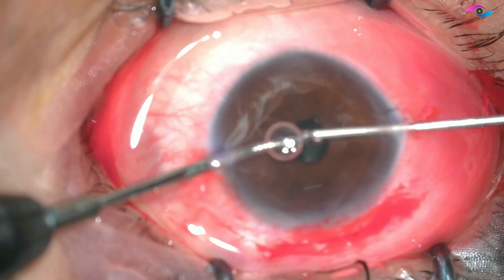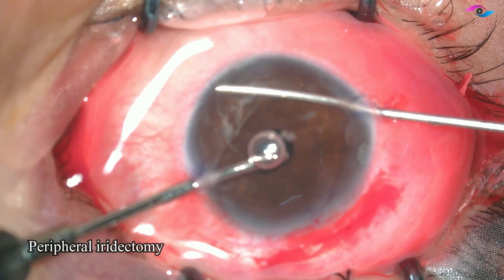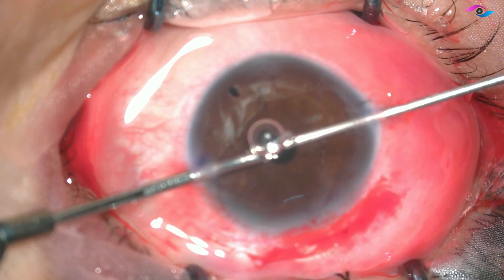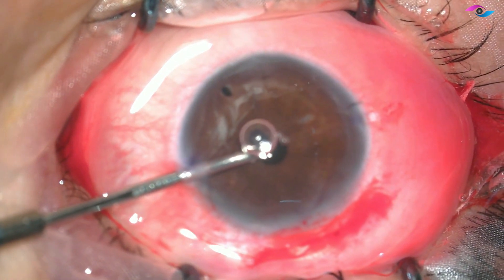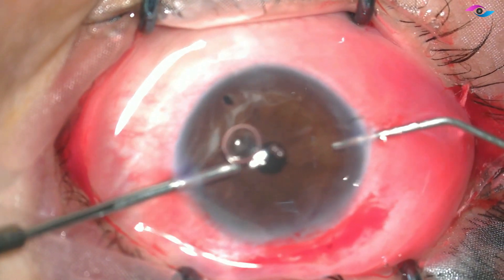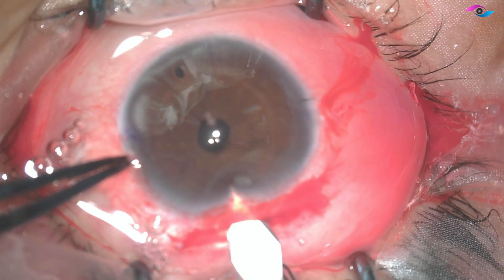Since the vitrector is already in the eye, I am making a peripheral iridectomy with the vitrector itself, which makes the job easy. Now that we have cleared the vitreous and made a peripheral iridectomy, to avoid chamber collapse I am injecting viscoelastic inside the eye and then removing the infusion cannula from the other side.